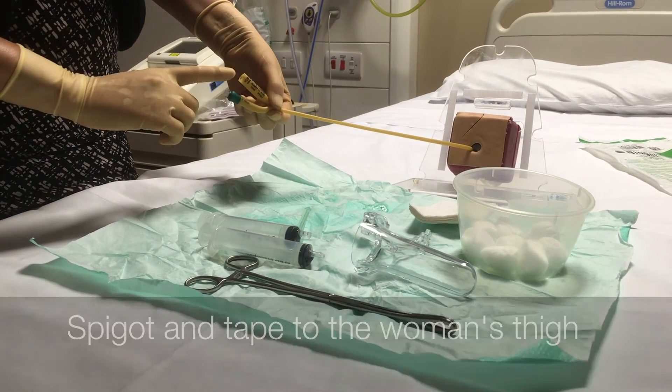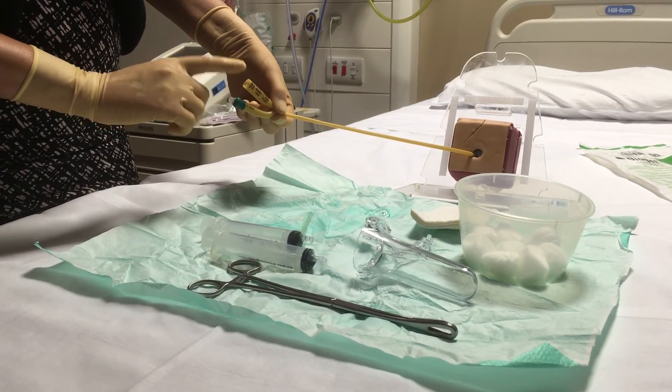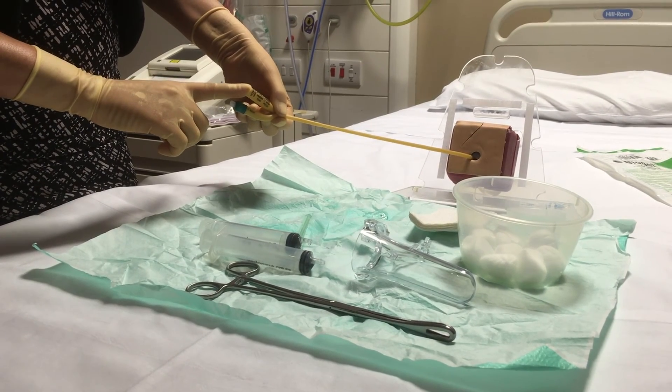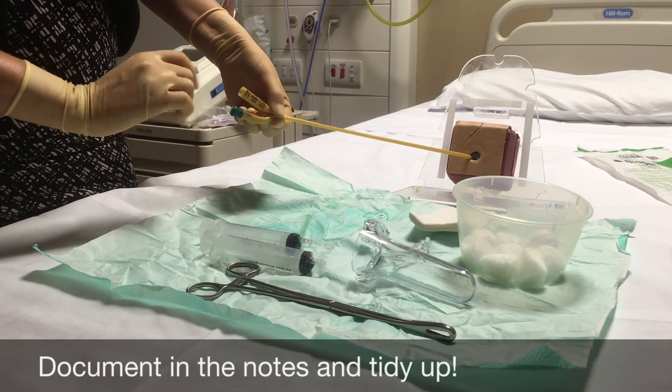We'll have spigots available so that you can put a stopper in the end of the catheter so none of the secretions from the cervix come out of the catheter.